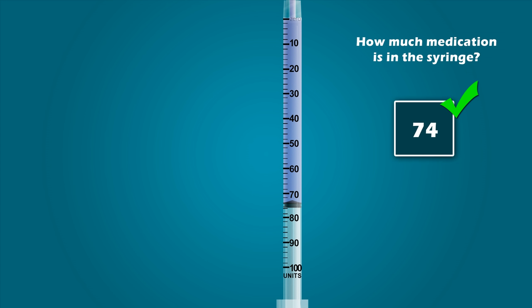Well, we went through all of the syringes, but before I end this lesson, I want to test your skills with a few random syringes. Once the syringe appears on your screen, press pause to figure out the answer, and then press play when you're ready to view the answer. How much medication is in this 3 milliliter syringe? How much medication is in this 1 milliliter syringe? How much medication is in this 5 milliliter syringe? And how much medication is in this 5 milliliter syringe?